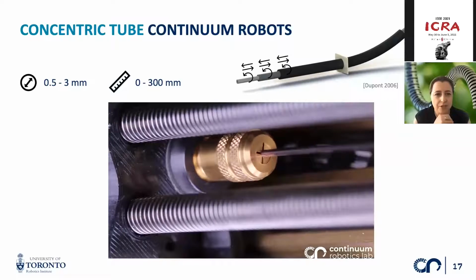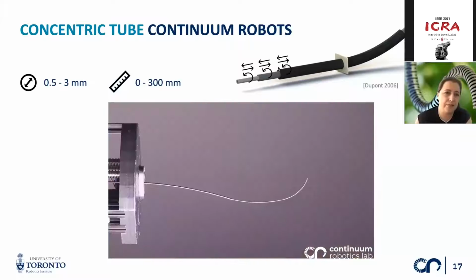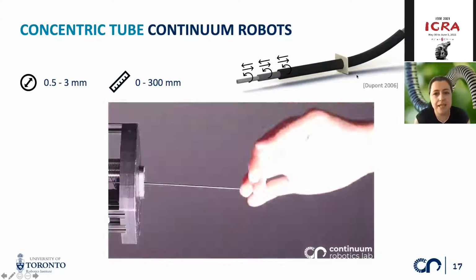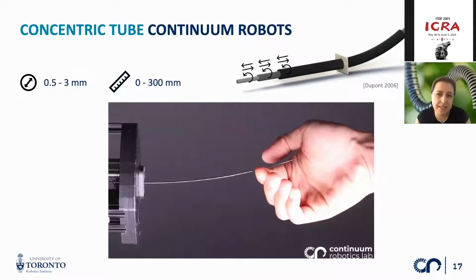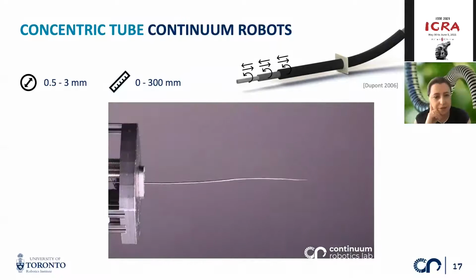And it's composed of several concentric tubes that are super elastic and nested inside of one another. And you can relatively translate and rotate those at their bases, and they will elastically interact, which defines the motion capabilities that we can see here and often refer to as almost like a tentacle-like motion behavior.